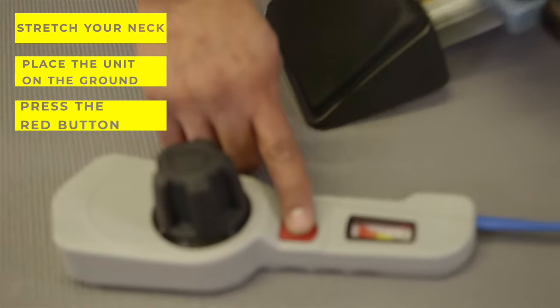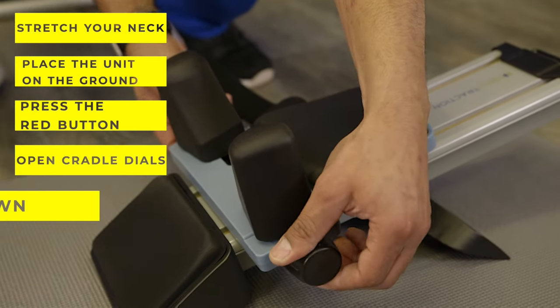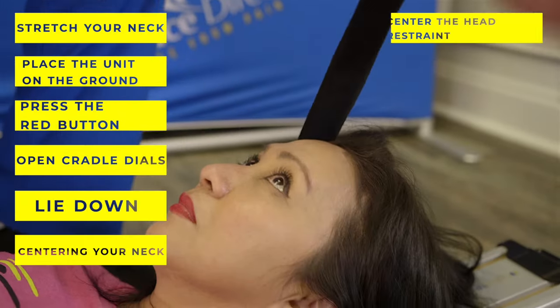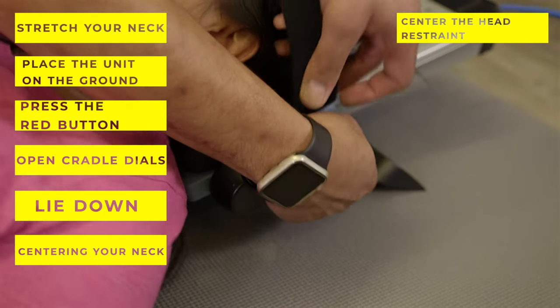Press the red pressure release button on the control dial to relieve any pressure. Adjust the cradle dials to open them up and then lie down, centering your neck in the neck cradle. Now center the head restraint on your forehead. Adjust the head restraint strap to your comfort. Now you are ready to begin your traction session.